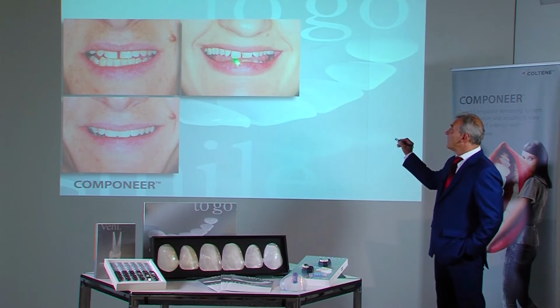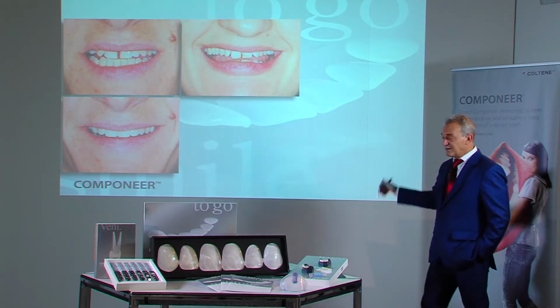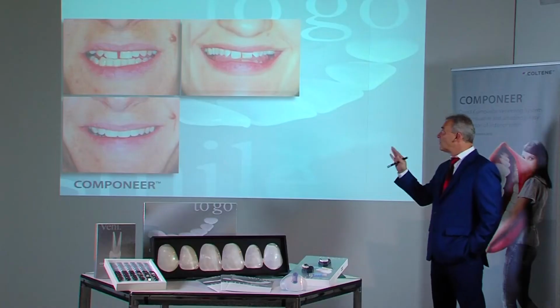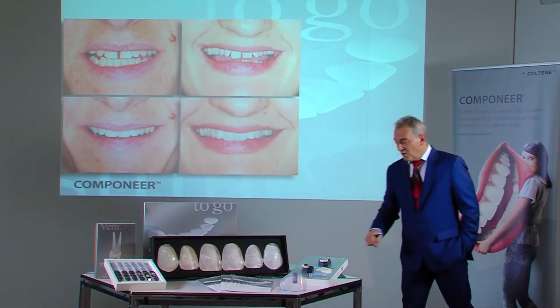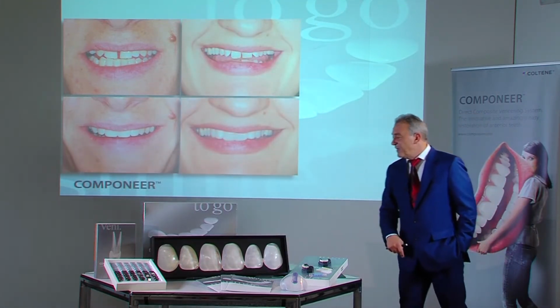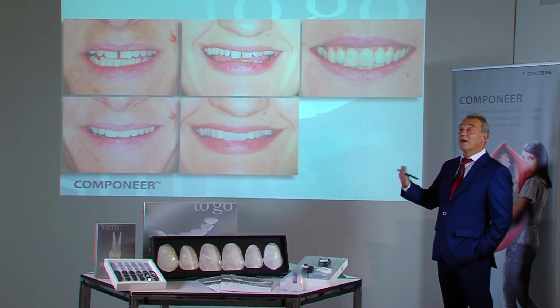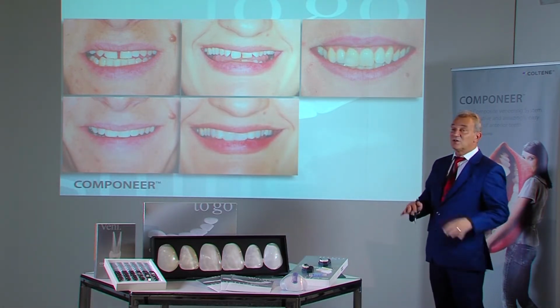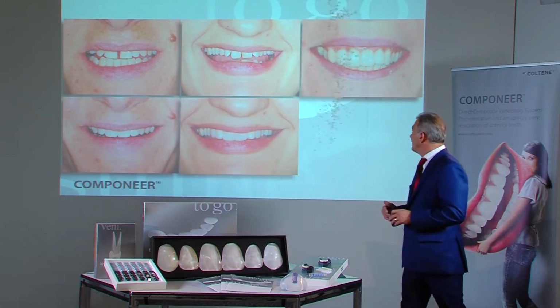In this case too, we have the lip contour. The teeth are actually slanted to the occlusion level, and again we have this pronounced contrast line. If the contrast is broken with a little composite, we get a completely different picture. This can be practiced on the patient. At first, one can also resort to using a model and apply composite on a trial basis to find out how it could be modeled and then presented to the patient.